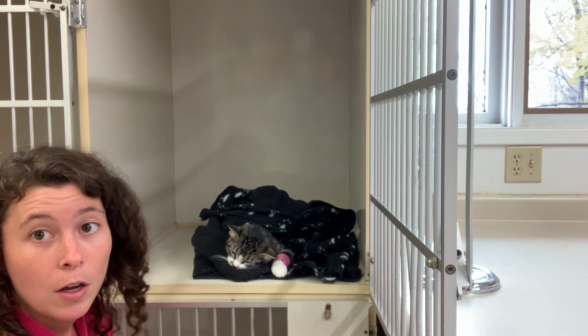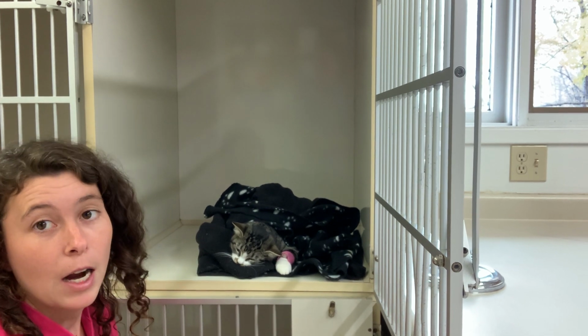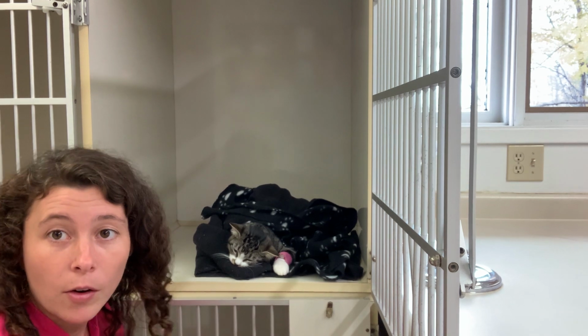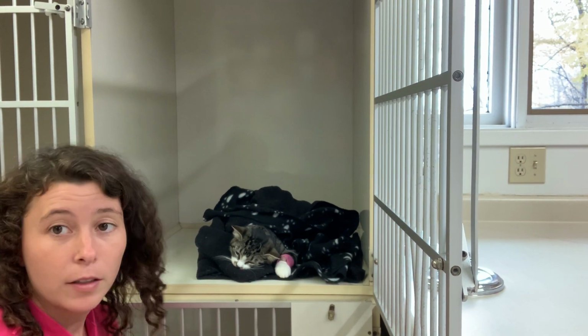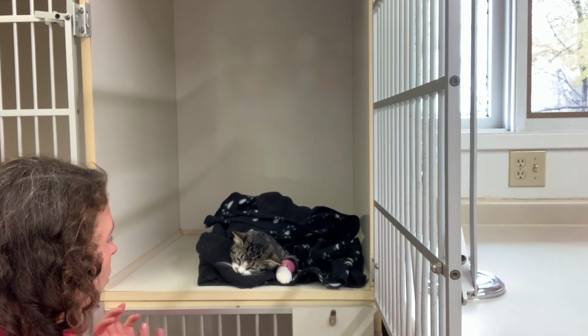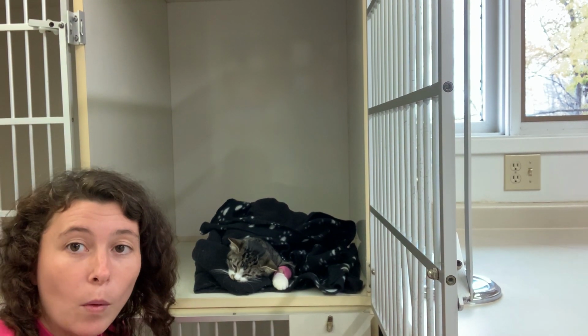And I'm going to continue to make sure that our patient is nice and warm. So I'll take a temperature reading, I'll do a heart rate and respiratory rate every 5 minutes, and I will also provide appropriate nursing care, meaning I need to take this catheter out, and I also need to make sure that I give post meds to the patient. And then once the patient is able to be in sternal recumbency by itself, I can then call the owners and let them know that everything went really well today.